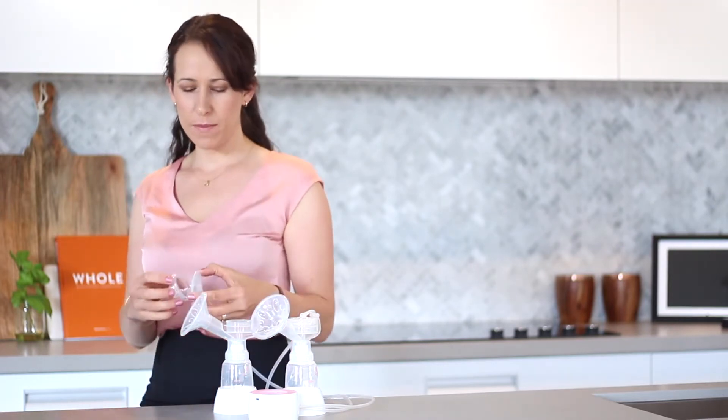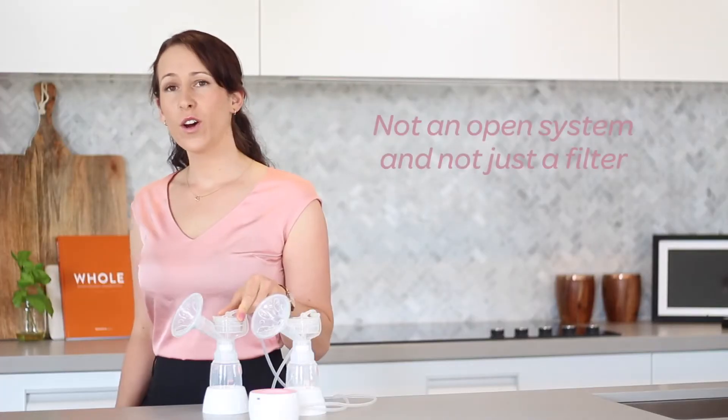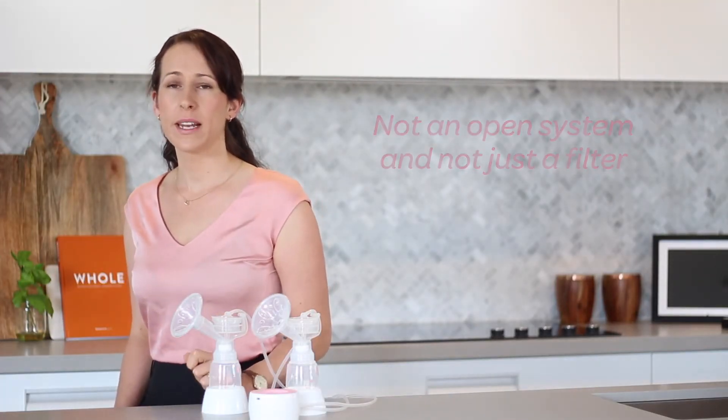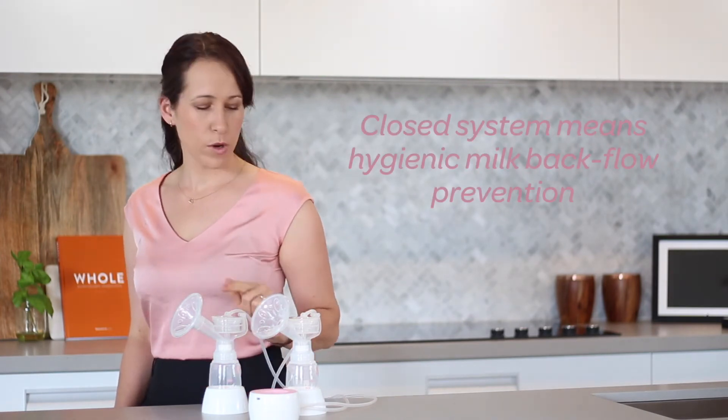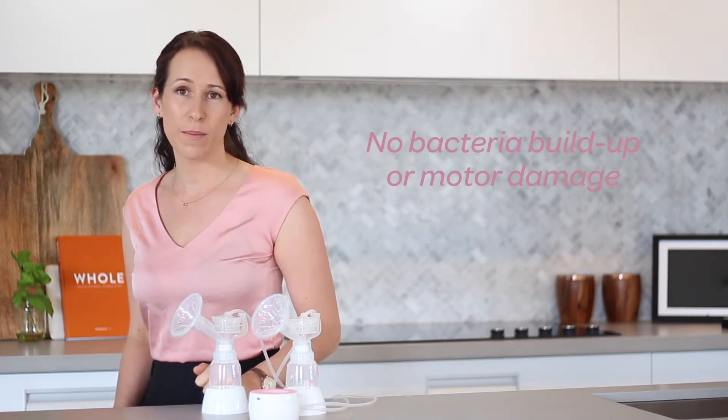Our breast pumps are one of a kind in that we have provided you with a hygienic safe option in our in-built milk backflow protection system. Not an open system like most pumps, and not just a filter like some pumps, but an actual closed system where milk particles cannot flow up the tubing and enter your pump, causing unhygienic bacteria buildup or potential motor damage.